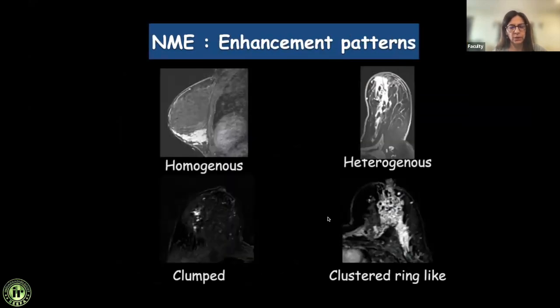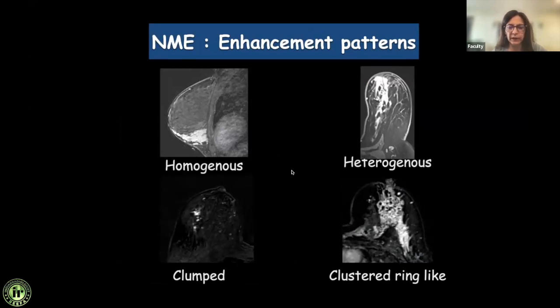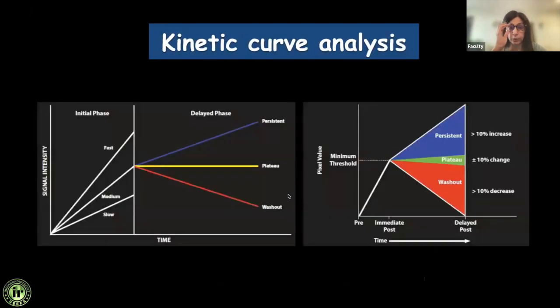Focal, regional, multi-regional, or diffuse can be seen in both benign and malignant cases. Like masses, in non-mass enhancement we also look at the internal enhancement pattern, which can be homogeneous, heterogeneous, clumped, or clustered ring-like. Homogeneous can be seen in benign conditions; the remaining three are normally seen in malignancies. In a country like ours, clustered ring-like is also seen in cases of tuberculosis.